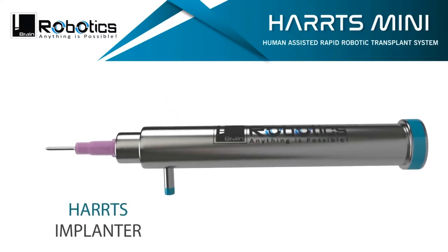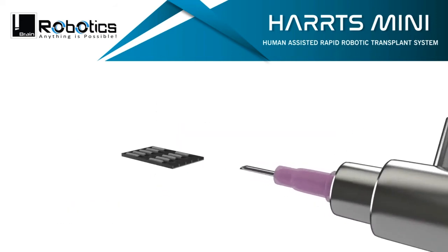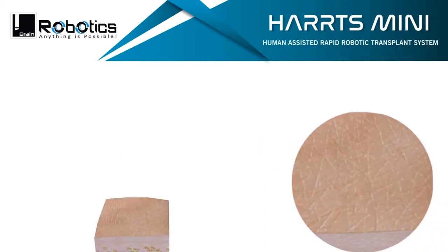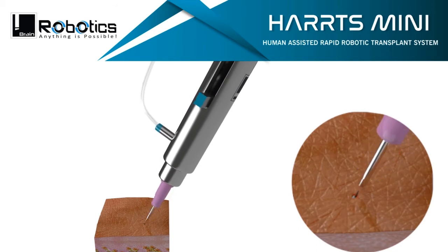The HARTS implanter is the world's best robotic implanter, which self-engages the grafts by mild and safe suction, and is capable of implanting without the need of creating slits in the recipient area, though it can be used with slits as well.